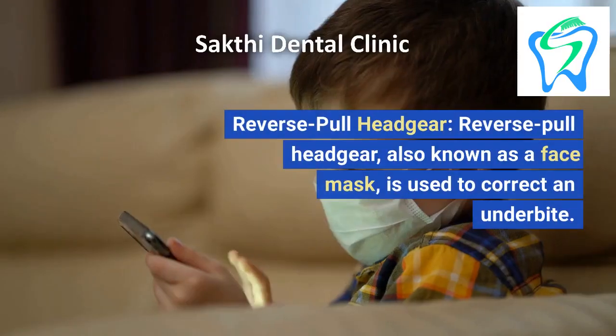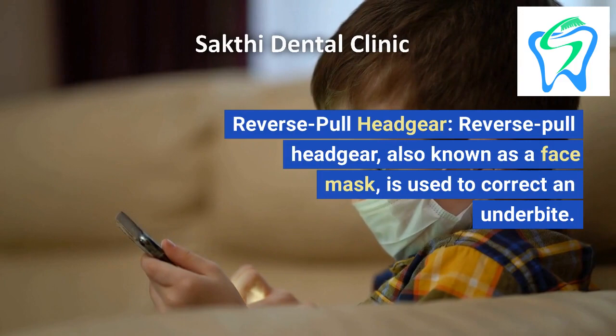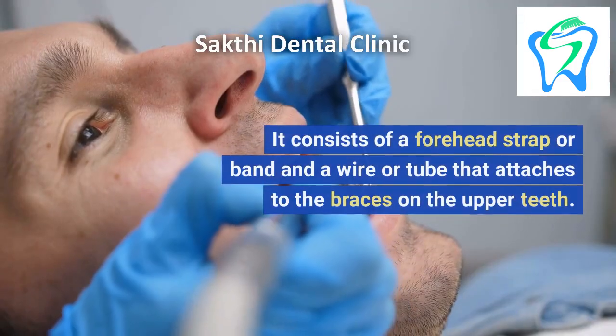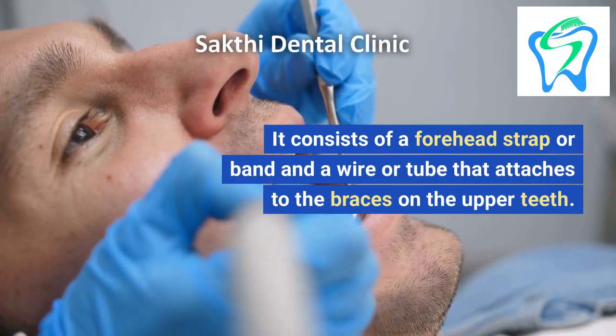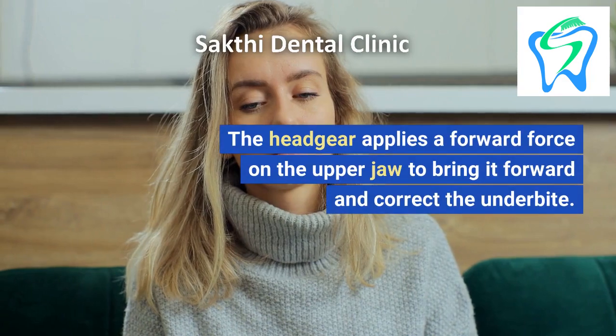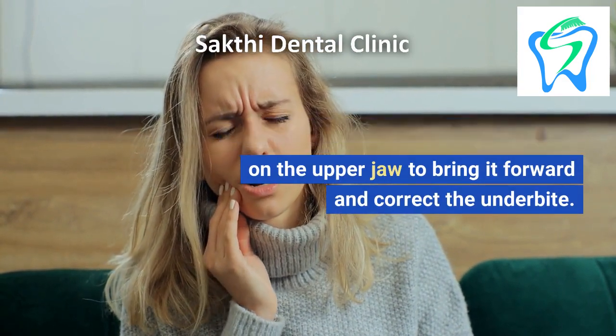3. Reverse Pull Headgear, also known as a face mask, is used to correct an underbite. It consists of a forehead strap or band and a wire or tube that attaches to the braces on the upper teeth. The headgear applies a forward force on the upper jaw to bring it forward and correct the underbite.